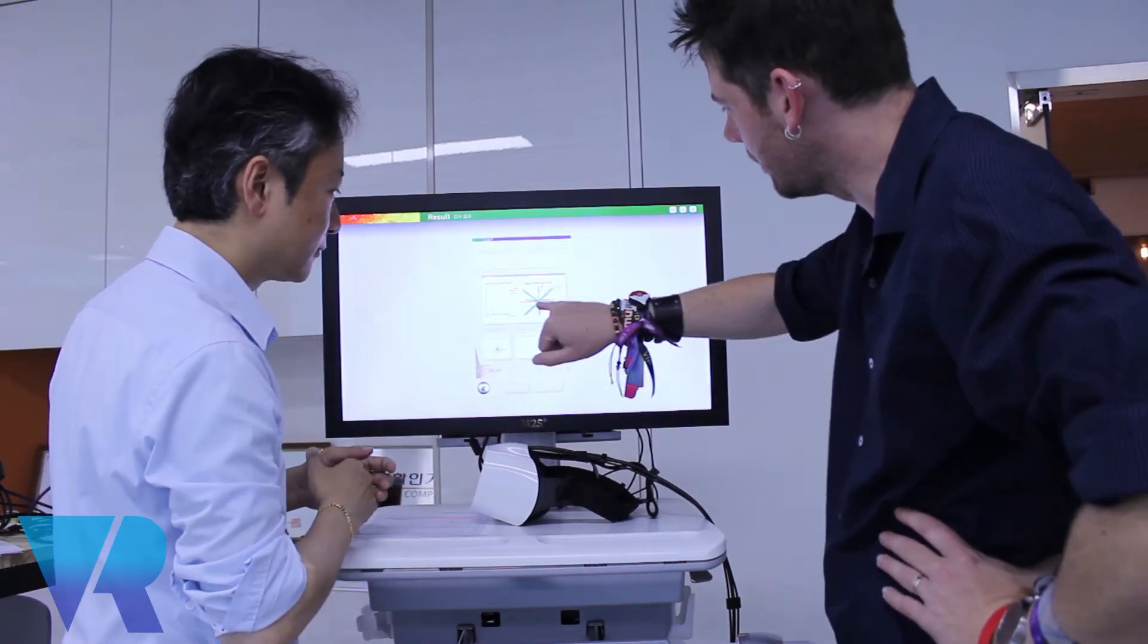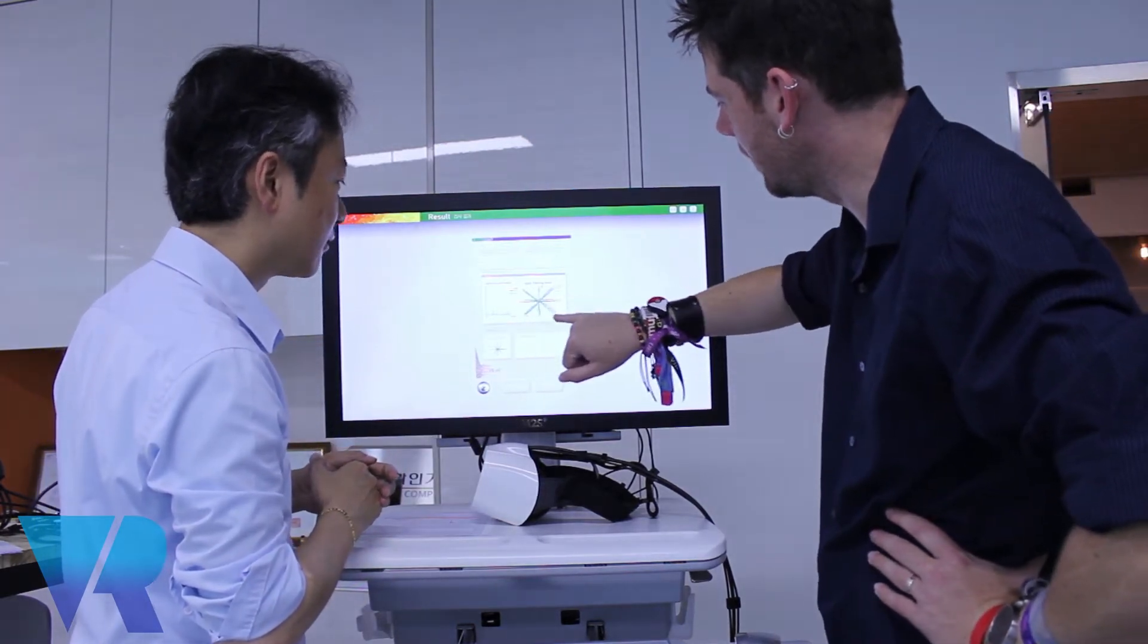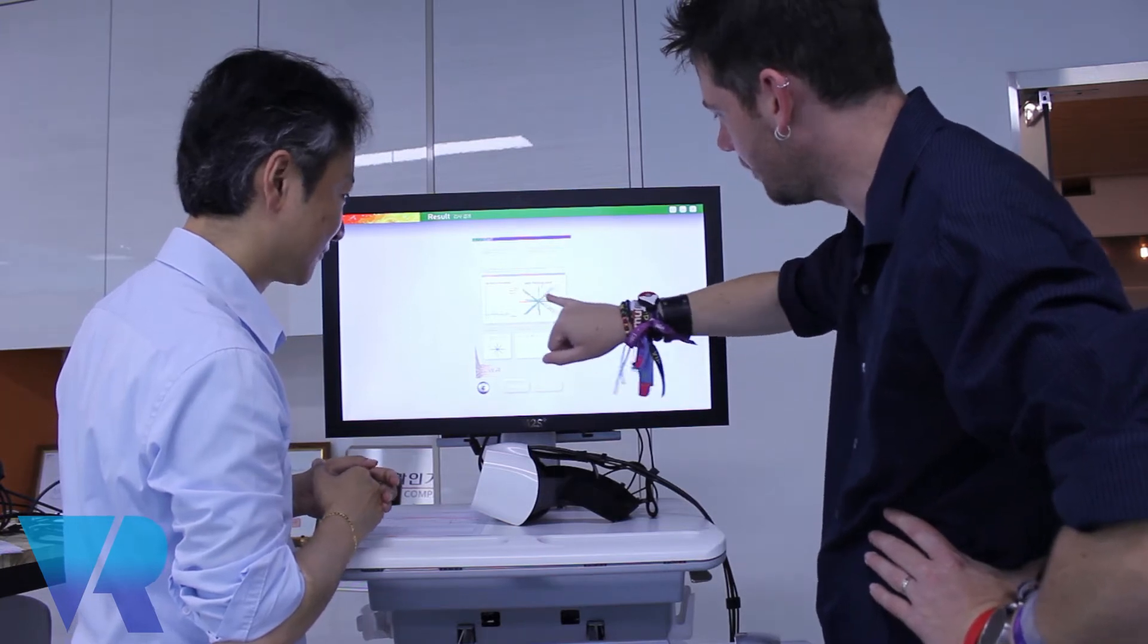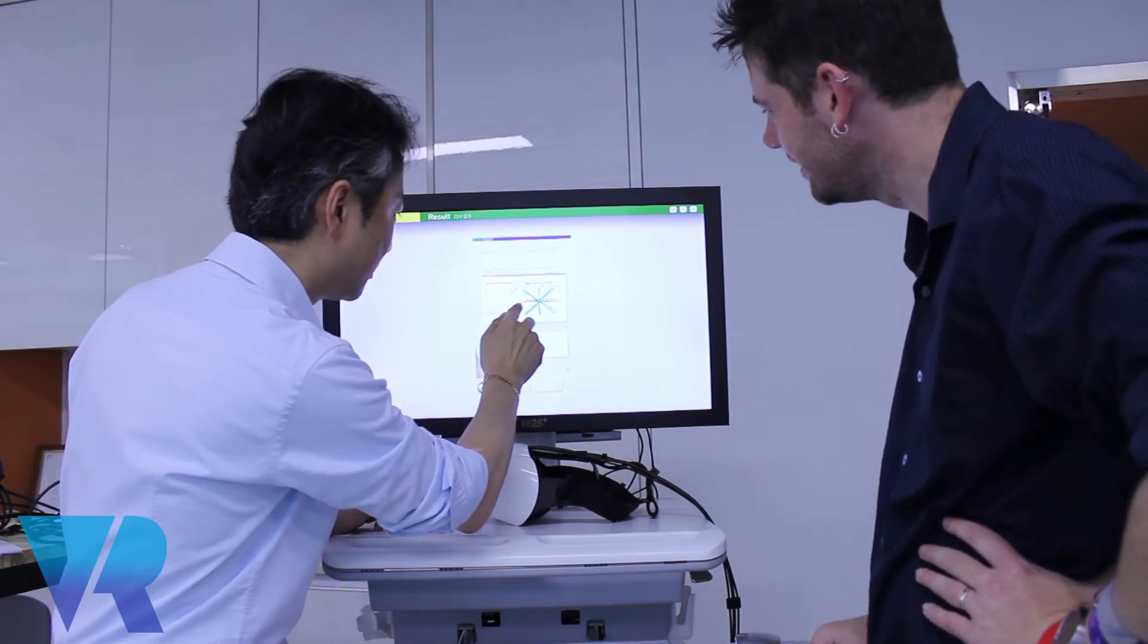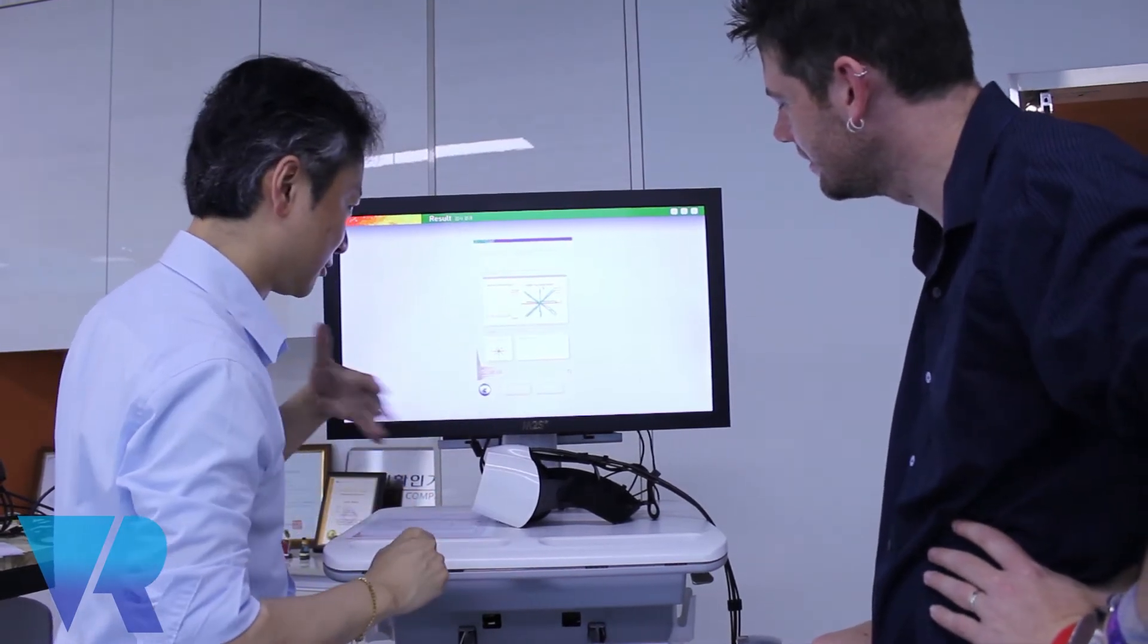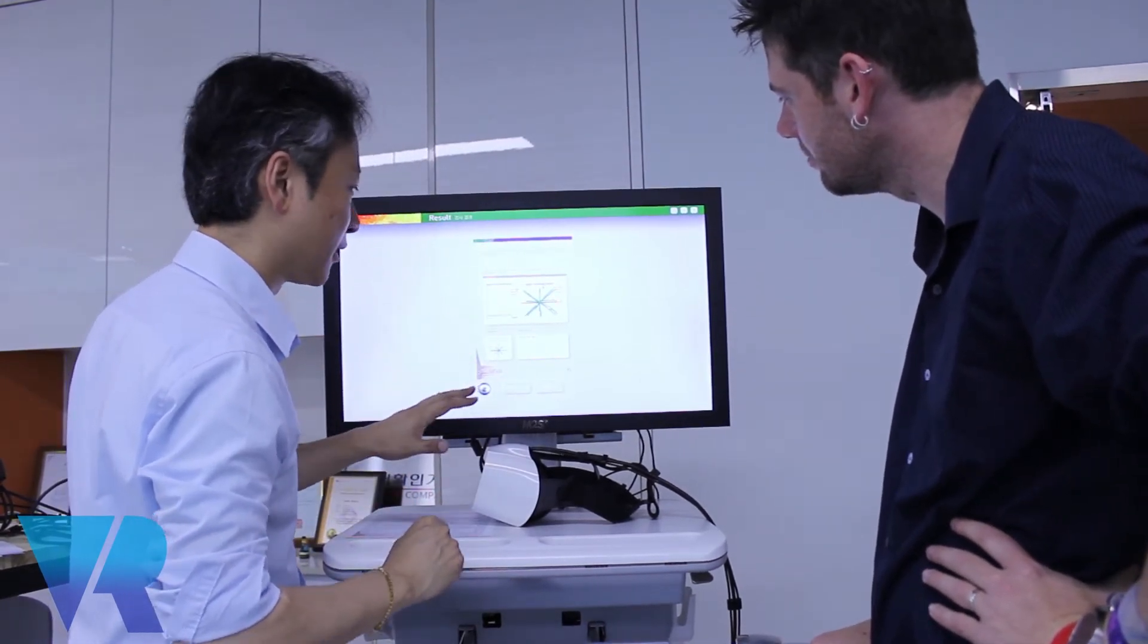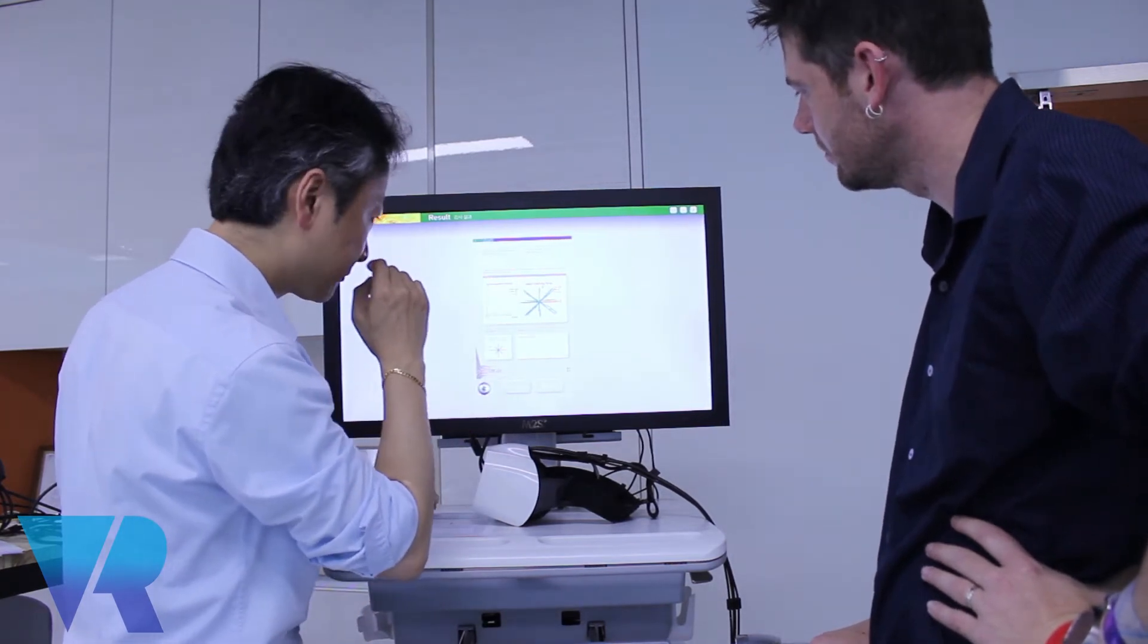Aside from the fact that I didn't go all the way here and that this one's a bit off, it seems pretty accurate, would you say? But usually this result, the doctor saying it's totally fine. You are working properly. Your eyes are working properly.